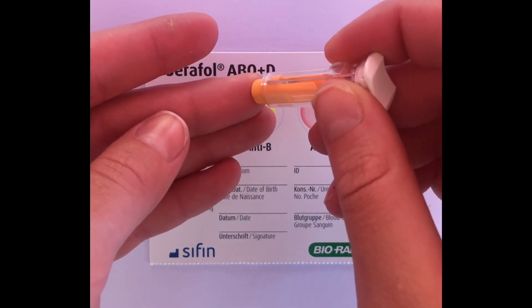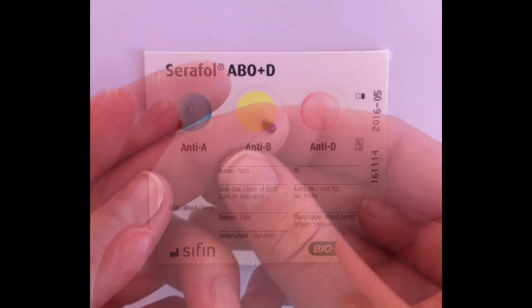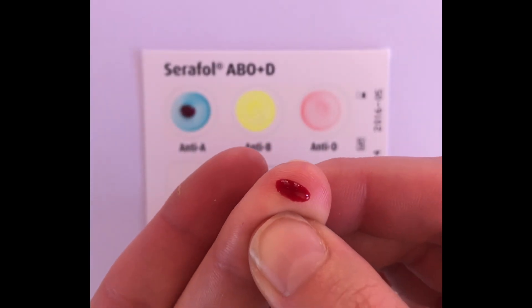Using a safety lancet, prick the patient's finger, remembering to clean the skin surface with an alcohol swab before. Add one drop of blood directly from the fingertip to each reaction field.